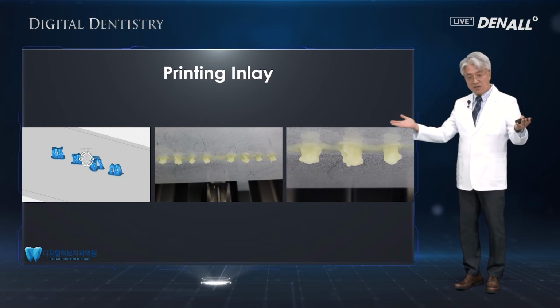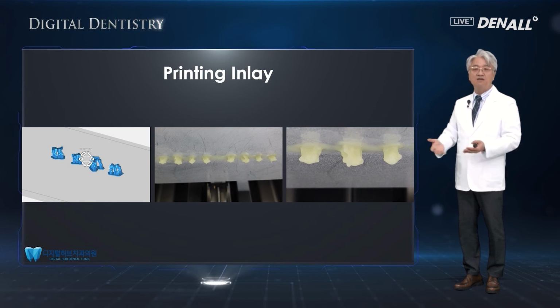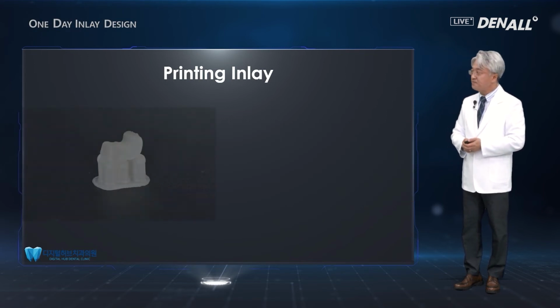And with the printing inlay, printing one or multiple inlays takes the same time. In other words, mass production is very much possible, and that is a very attractive advantage.